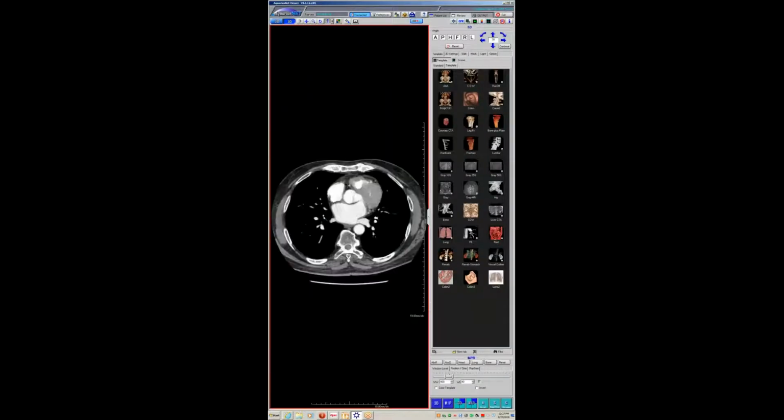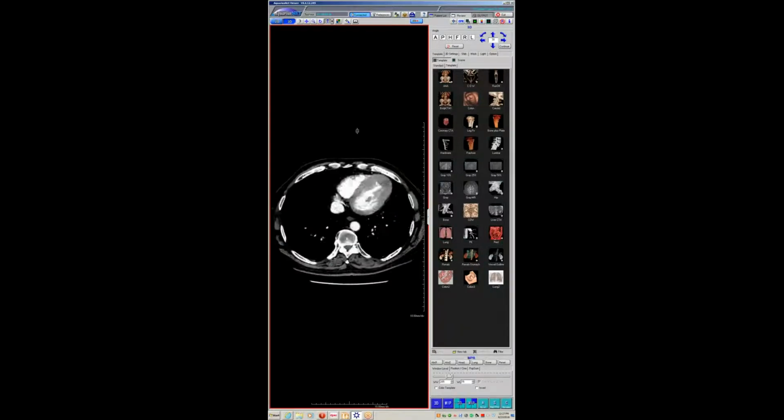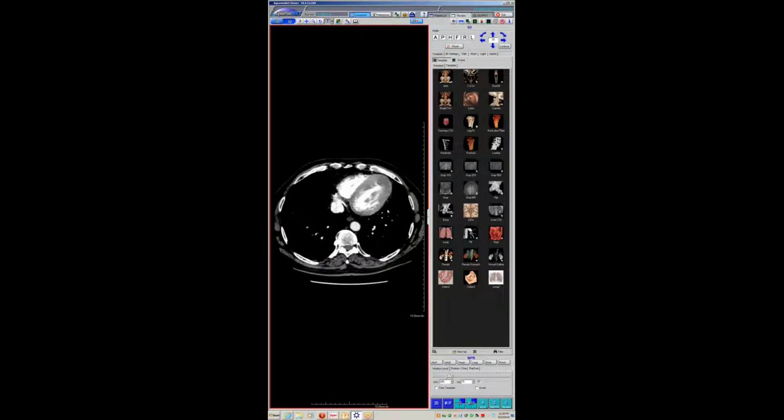Yeah, and I think if she hadn't had the centrilobular emphysema everywhere else, then yes, I'd be more likely to call it absolutely developmental. But I think, as David said, it makes you wonder if it's just smoking related. Yeah, that's what I was wondering, because she had really bad emphysema everywhere else, but it was so dramatically worse in that one lobe, and I've never seen it in adults, although you guys have, and I'm still torn, but I'm glad to know that. Let's call it vanishing lung, and she's the right age, but the wrong sex, and it's the wrong location. But people aren't perfect.